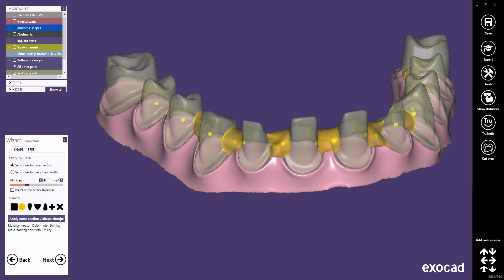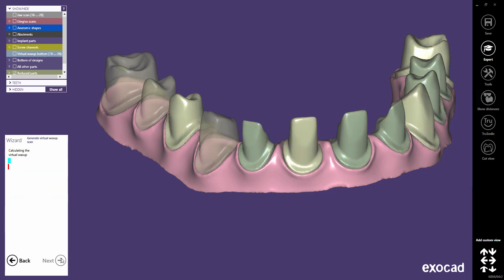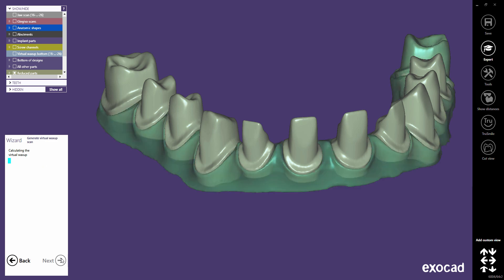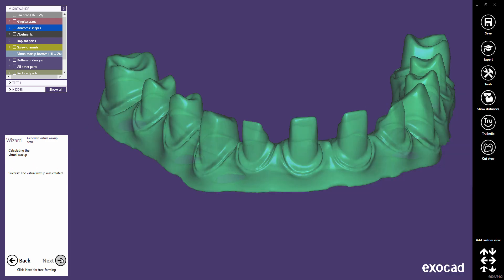Starting with Exocad version 2016, you can delete all connectors with a click in the Connectors dialog. Click Next to merge all meshes into a virtual wax-up. This operation may take a while. Then click on Next to freeform the whole merged restoration.